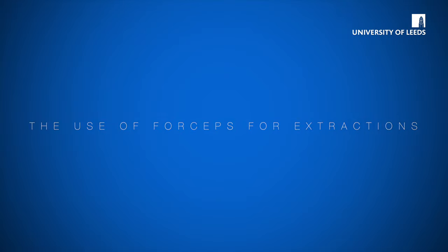Welcome to this short video explaining the basic use of forceps for exodontia. It's important that you appreciate the use of elevators and also luxators, but this will explain the basic principles of forceps use.